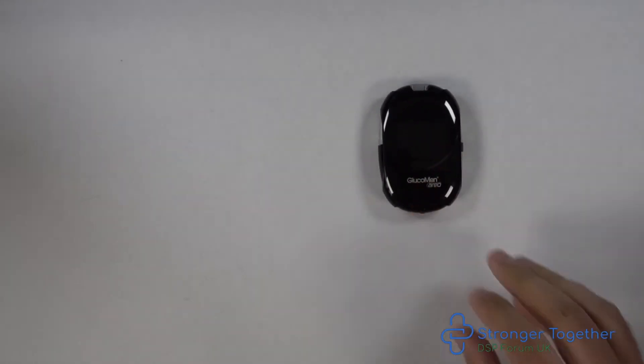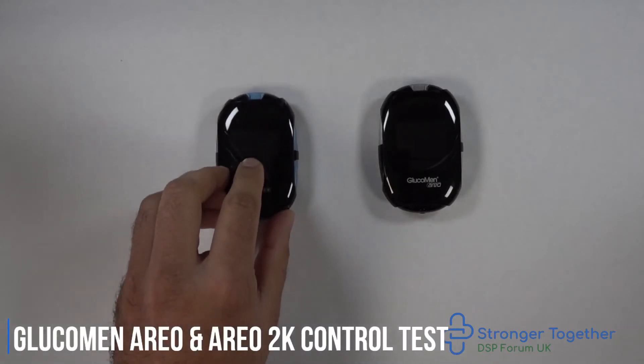In this video we will cover how to perform a control test of the testing strips which are used with the Glucomen Aereo and Aereo 2K meters.